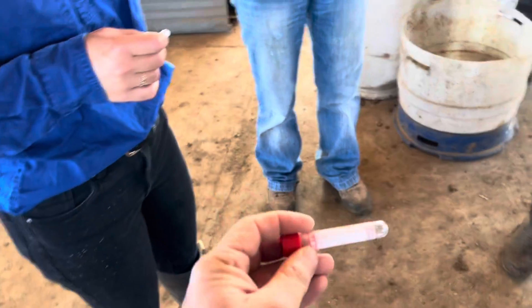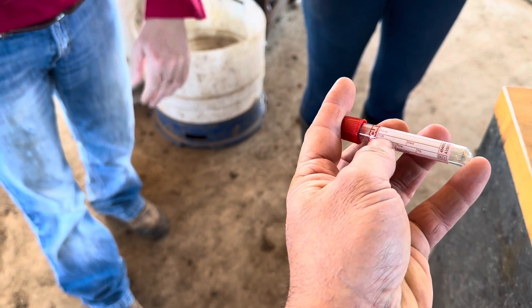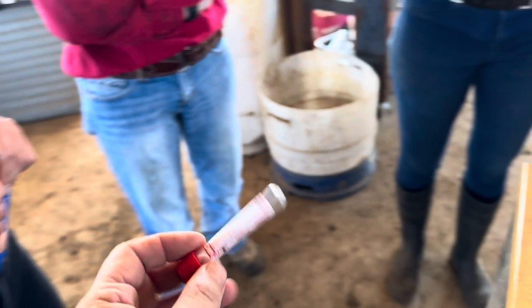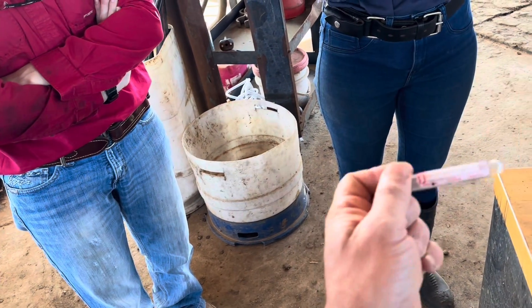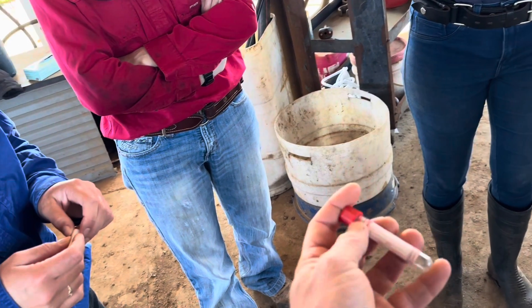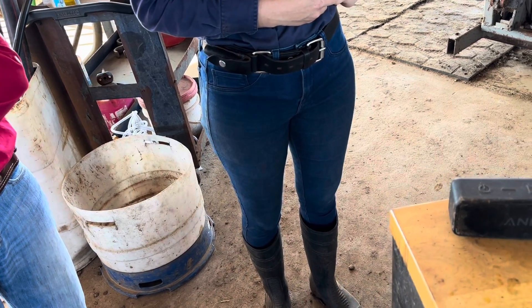Write the ID of the animal on the tube. In the human healthcare system they've got surname, first name, chart number, date of birth, ward, date, time, signature, et cetera. We just want the ID of the animal. But you always want to do it the same way — if you're right-handed, hold the tube in your left hand and write the number from left to right, so numbers don't get mixed up. Always hold it in one hand and write the number across from left to right.